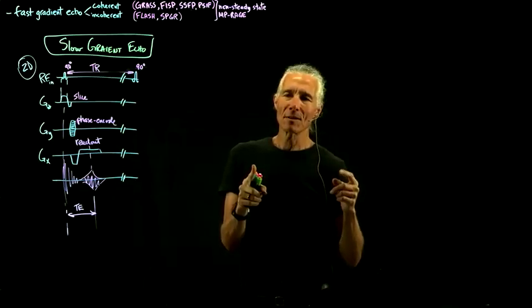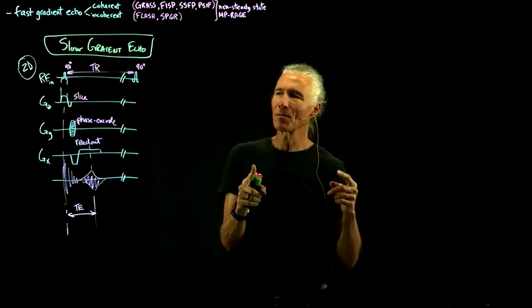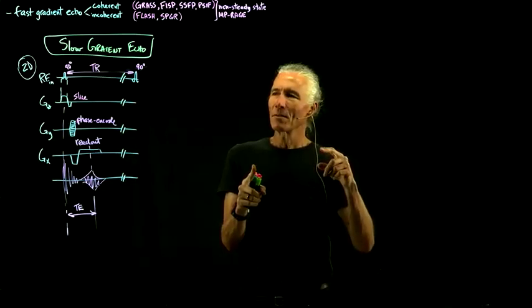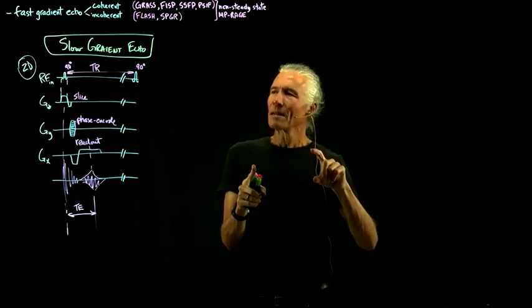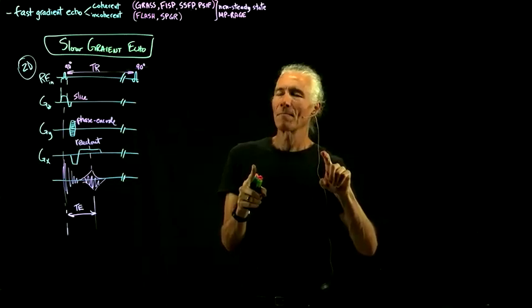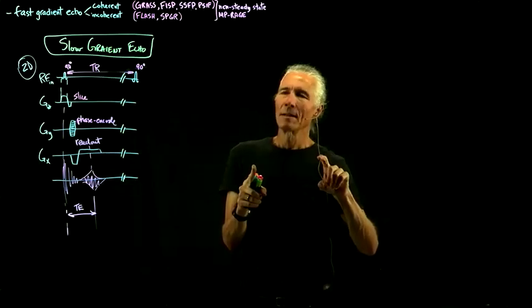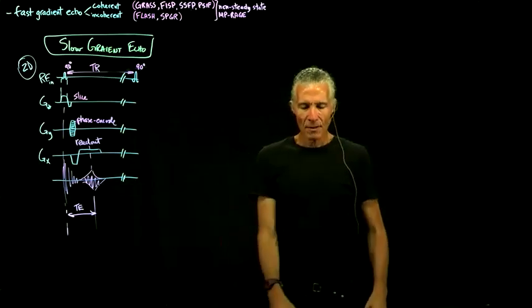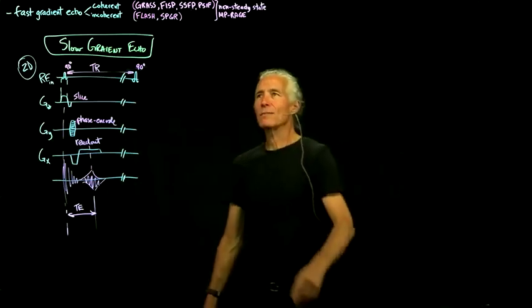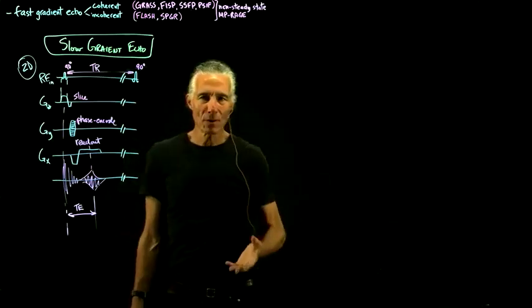But then you've still got some magnetization left, transverse magnetization. So it might be hidden, but it's still there. And so you patch up whatever you did so that you can record another echo, a train of echoes. And so the idea of GRASS is, why don't we do the same thing with a gradient echo?